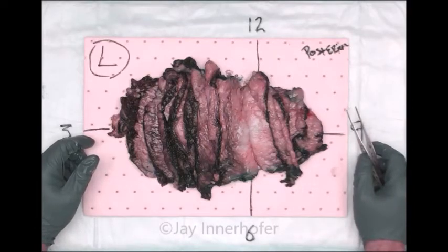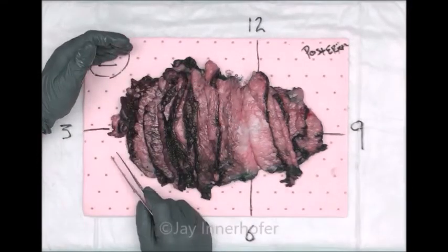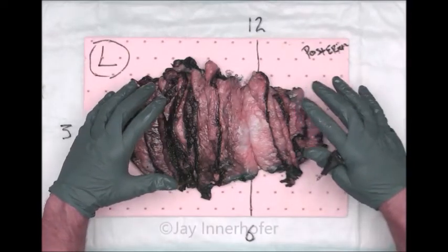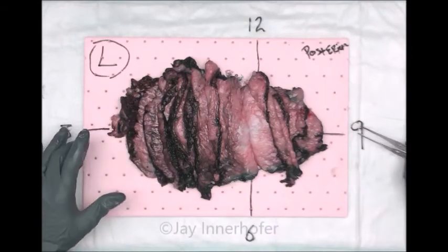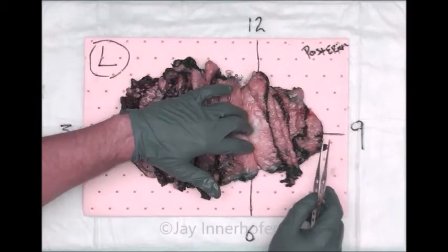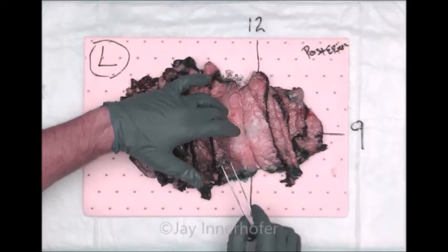So I've sectioned the specimen, I've palpated it, and this is what I found. As I sectioned from the medial to the lateral aspect, looking at the breast from a posterior view, we've got our clock face here, 12 o'clock, 6 o'clock, 9 o'clock, and 3 o'clock here. This is the left breast. As I go from medial to lateral, here are the nipple ducts, okay?